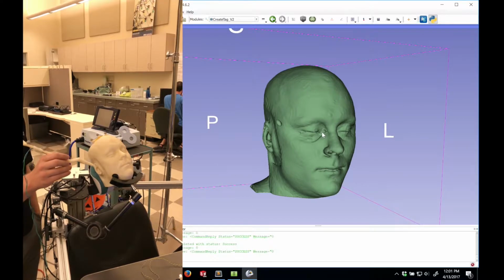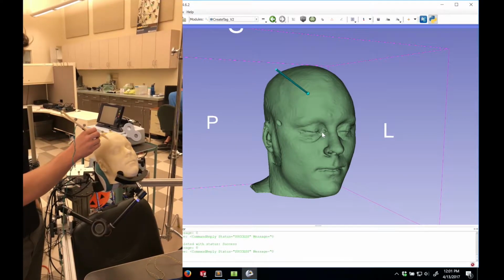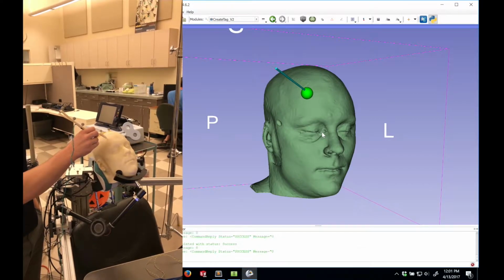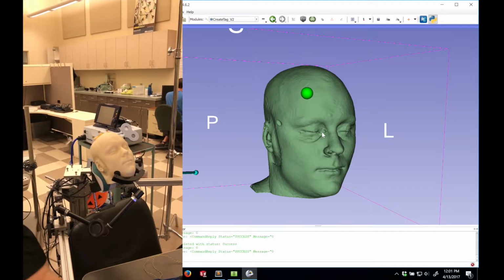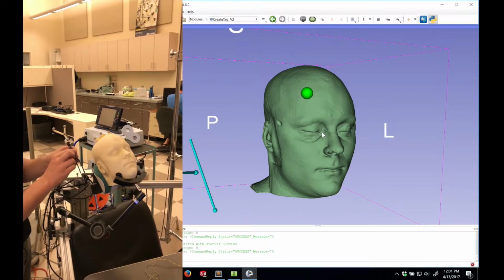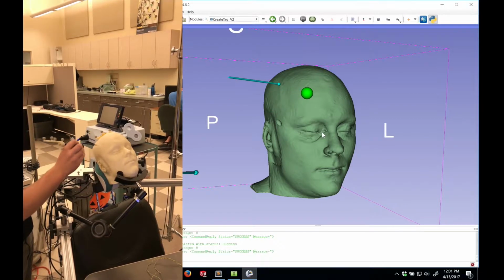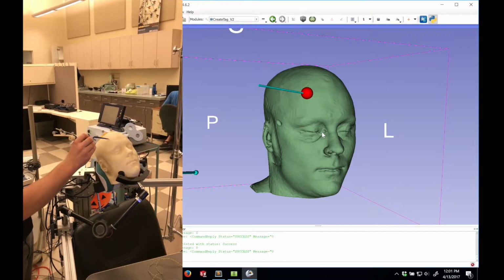This process is demonstrated here. First, the novel cortical stimulator is used to apply a tag to the surface of the head. Then, the user switches to a tracked bipolar cautery. When this tool encroaches upon the tagged region, the user receives visual feedback in the form of a color change on the navigational interface and an auditory alert.